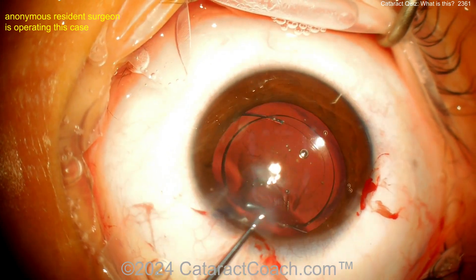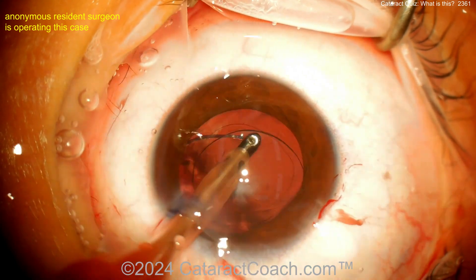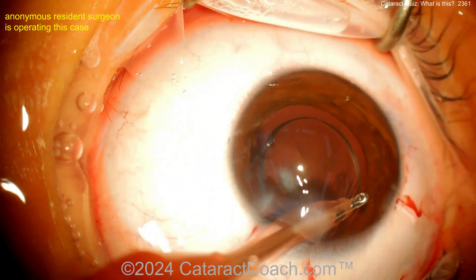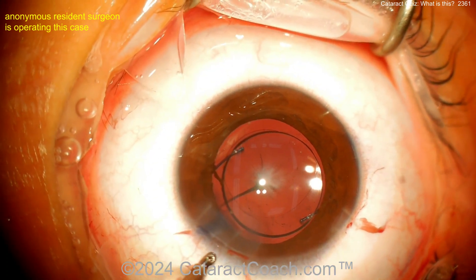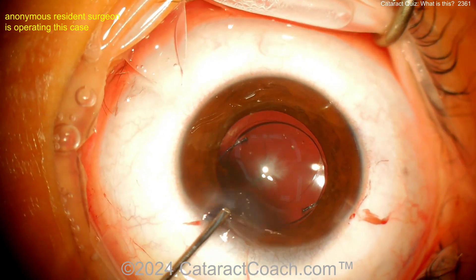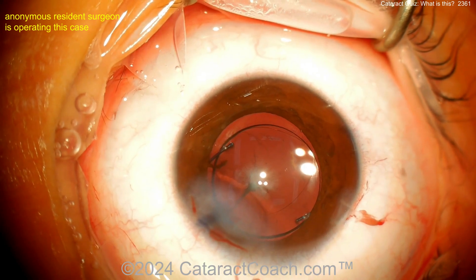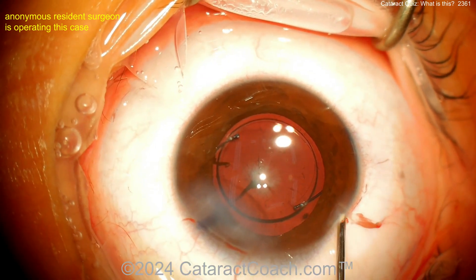Should you intervene here — perhaps do a posterior capsorhexis to cut off the vessel attached there? This fetal vasculature does predispose the patient to other issues in life, such as cataract, glaucoma, and even posterior segment disease. You also have to be careful because this can be amblyogenic — if it's occluding the visual axis, the patient could develop amblyopia. It's imperative to diagnose this at a very young age and treat the patient appropriately.